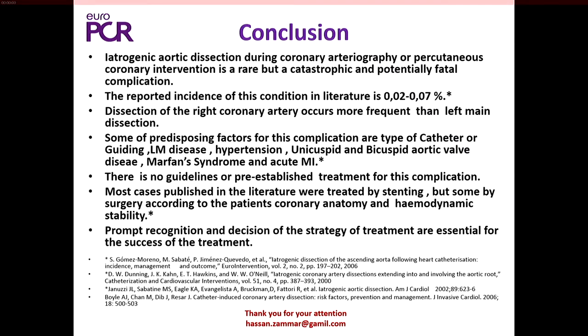First of all, you did a small angio, and then you saw what was happening with the hematoma inside the aortic wall and in the aortic lumen, and then you changed the guiding catheter from extra support to a softer and more gentle one, like the Judkins left.